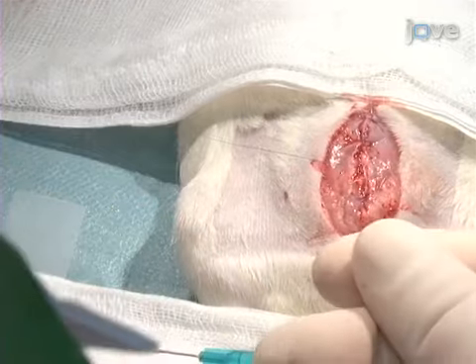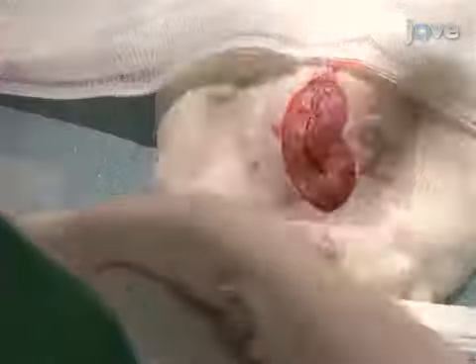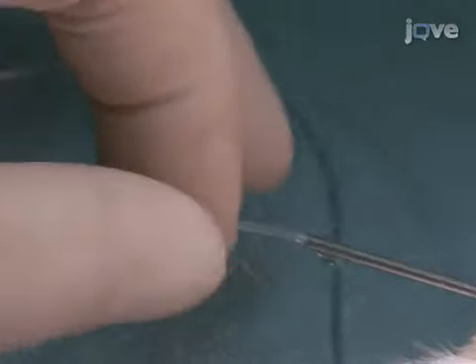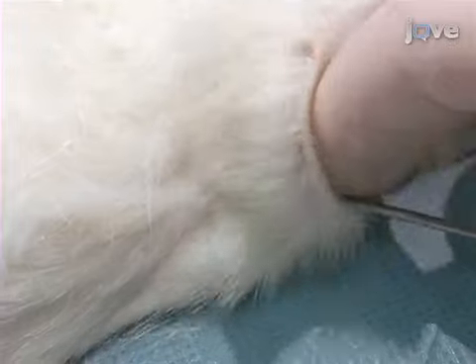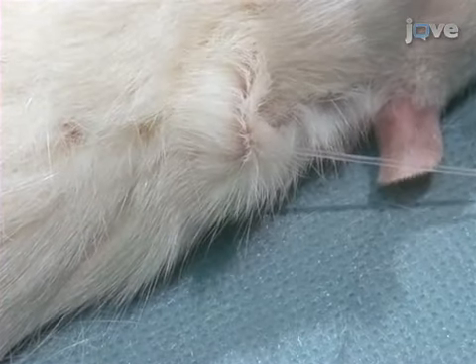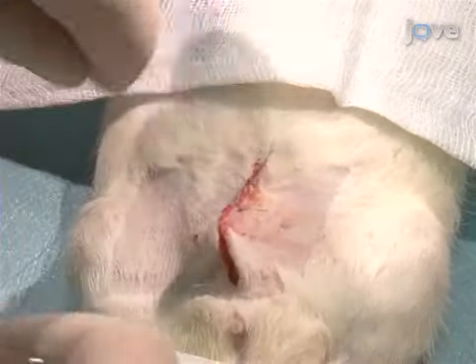Now close the abdominal muscles using monofilament sutures, leaving a passage for the catheter in the upper part of the incision. Tunnel the catheter into the interscapular region using a hollow metal rod, thereby preventing the animals from biting the tube after the surgery. The metal rod should be placed under the skin and above the abdominal and dorsal muscles. Push the rod through the animal subcutaneously to the interscapular region. Complete the surgery by closing the abdominal muscles and the skin with non-absorbable monofilament sutures.